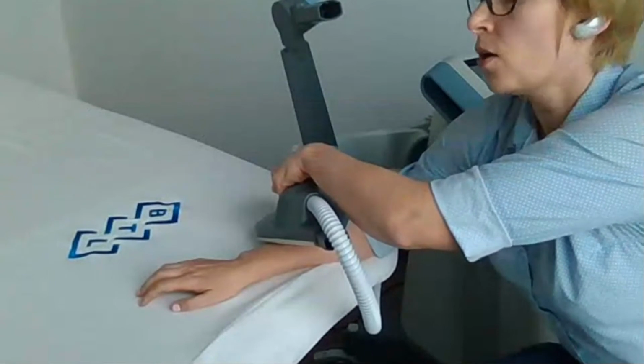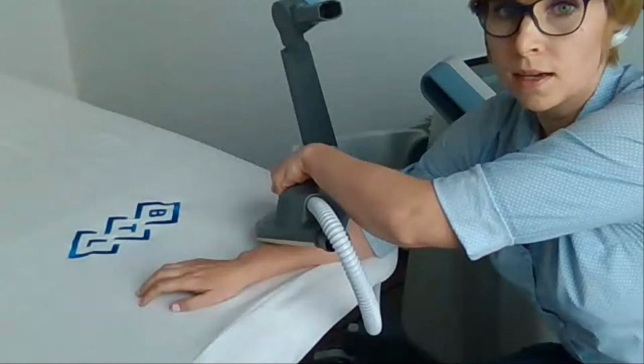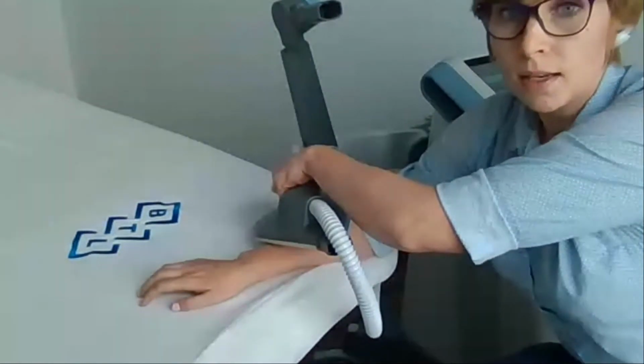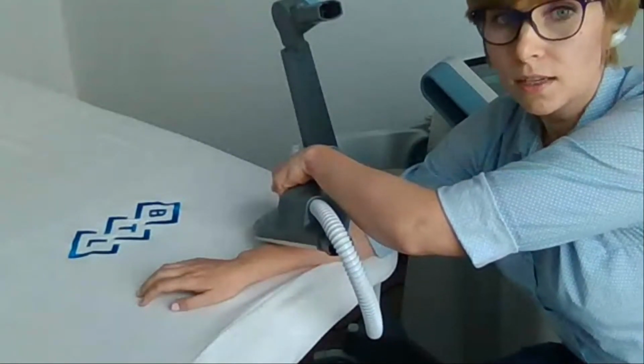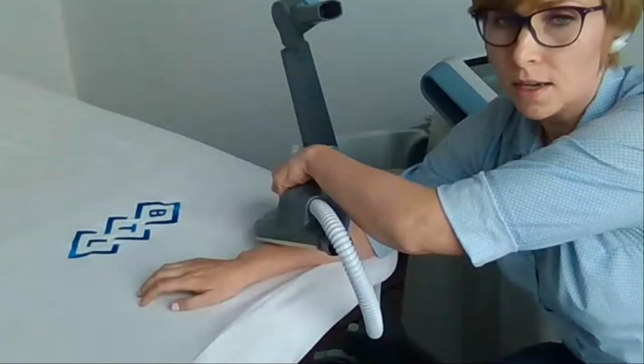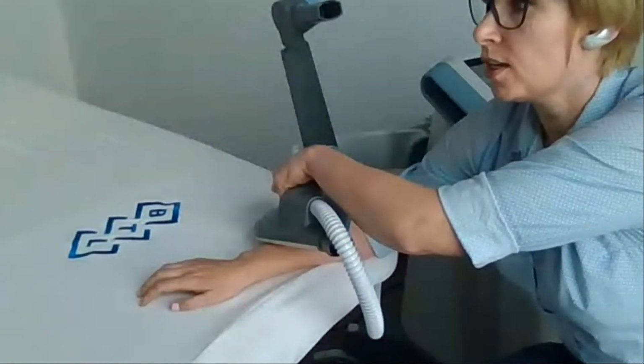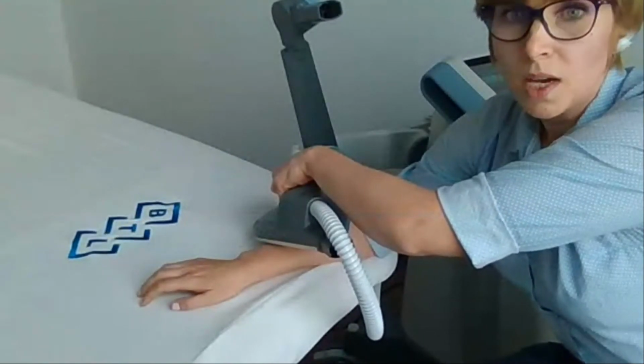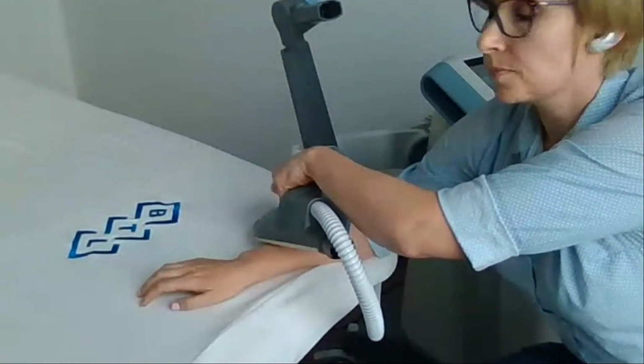So as you can see now, in the very beginning, the first 30 seconds were quite intensive, and now the frequencies and the intensities are changing, so they modulate. That is the reason why after 30 seconds we are not changing the intensity, because if we would change the intensity at other frequency levels, it might be uncomfortable for the patient.